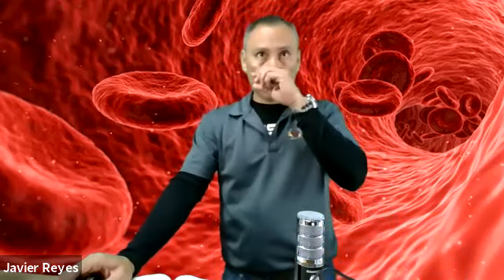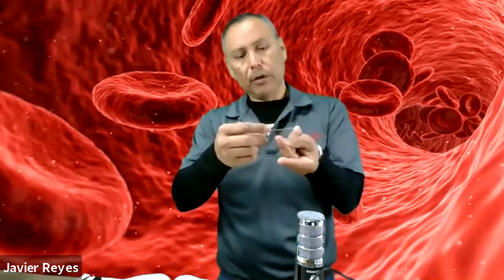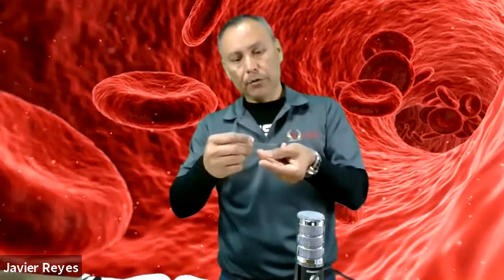I touched a little bit on peripheral smears. These again are done using a capillary puncture. You're going to be working on adults, so we'll obviously be using the third and the fourth fingers, either or. Remember to arterialize your specimen so you can get a good blood flow going. You're going to grab your slides and put one against the drop of blood. Make sure you wipe off the first drop. Then put your drop of blood here.